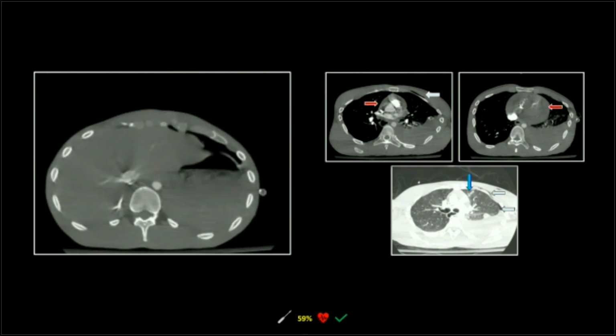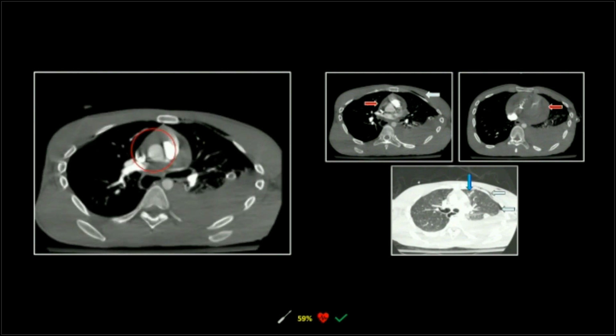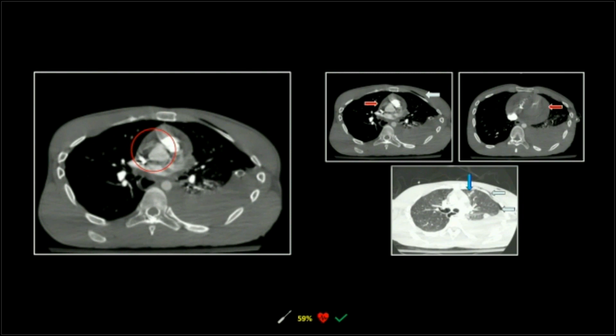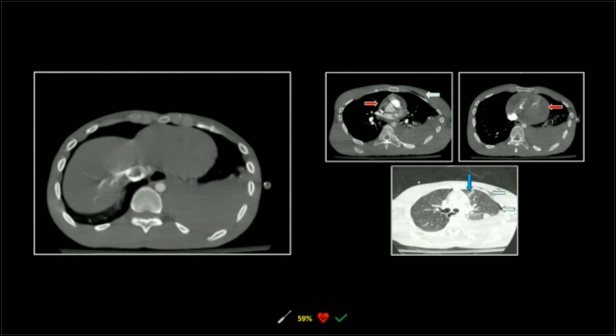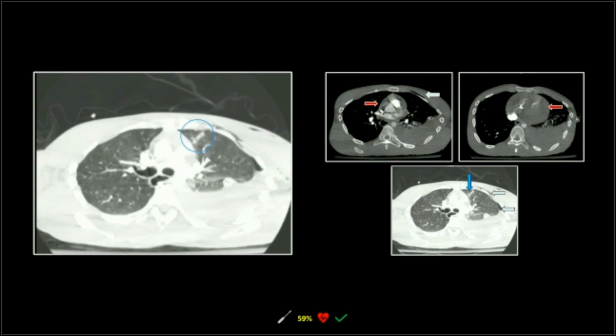This guy went to surgery so quickly, I read his post-operative follow-up chest x-ray during the same shift. And so he actually made it. But that's a great lesson on the potential distractor that some of these injury vectors can create.